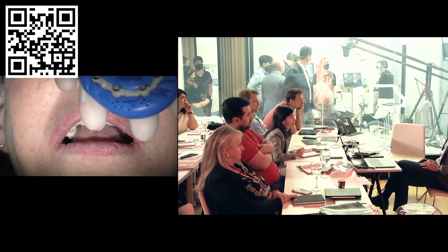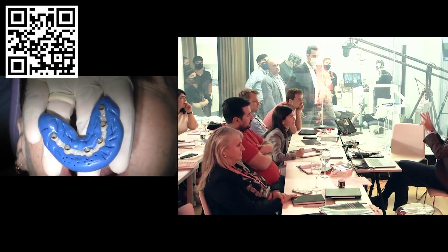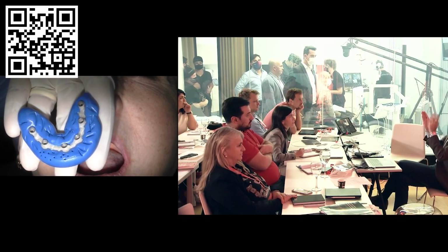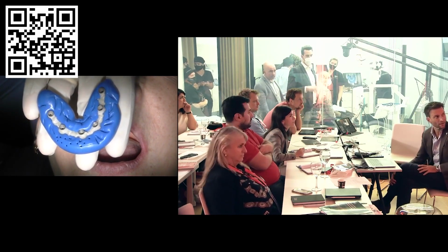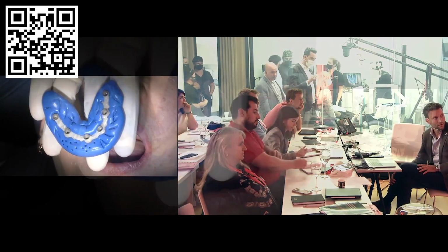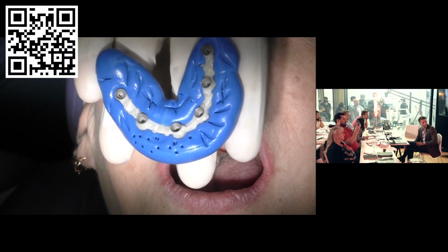Many times you need to cut in more than one place, because if two implants are precise and this one is off, you need to cut here and splint in two places, right? In many places. And then when everything is already connected, splinted, you need to do it like this with this silicone, because if not, it's so hard to scan, the scan gets lost.